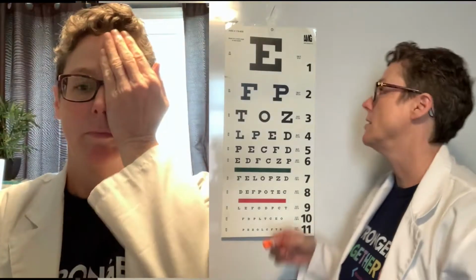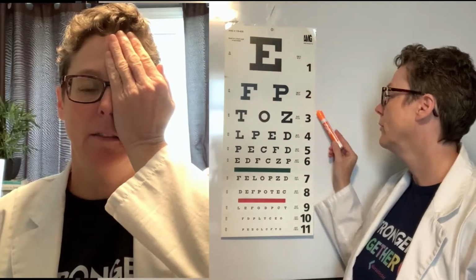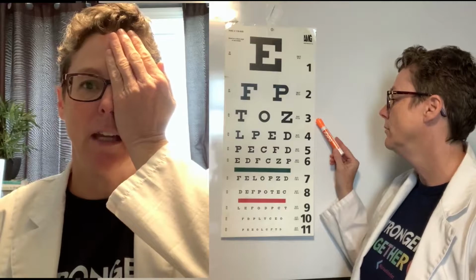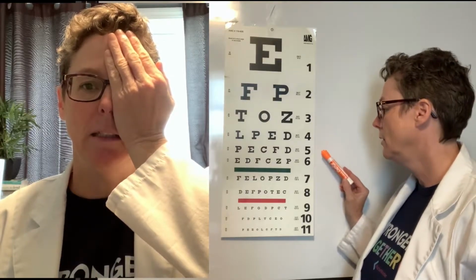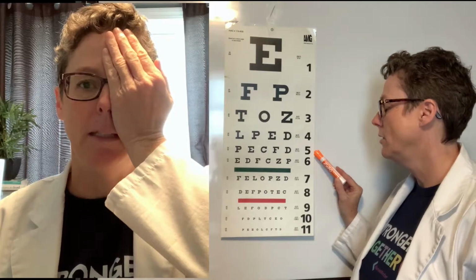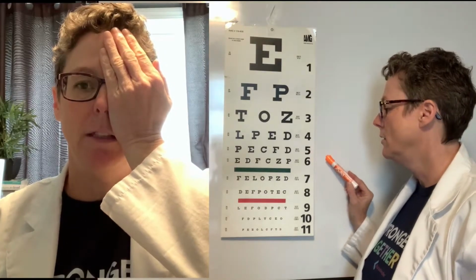Visual acuity is what a person sees and is measured by what they read off a chart. This is one of the most important outcomes measured following a cataract surgery. Typically, a patient is asked to cover each eye and thereafter responds to symbols from a chart at a distance. This is thus dependent on human response, light, and attention of the patient and the person recording.